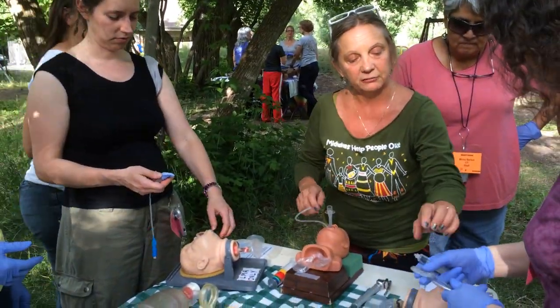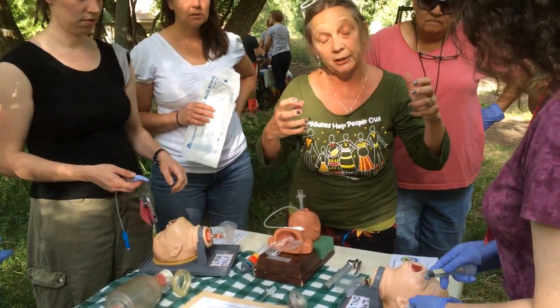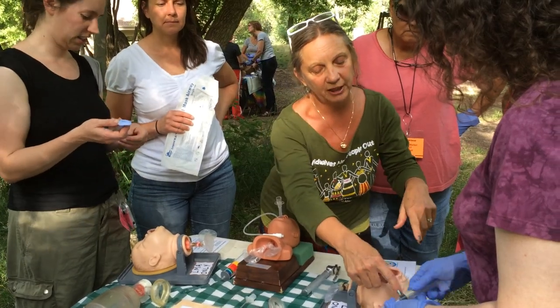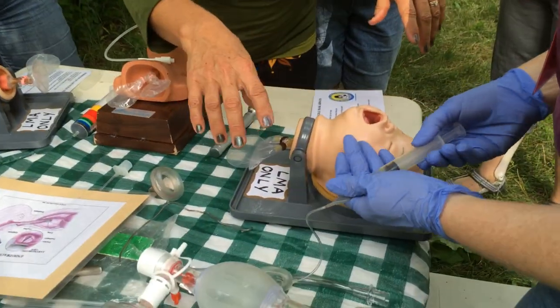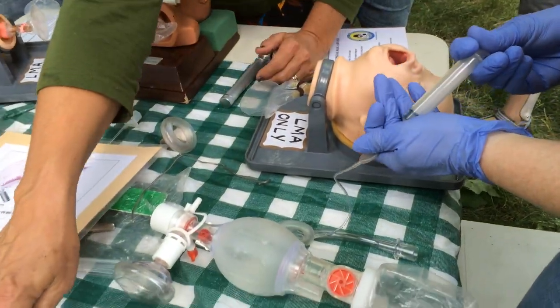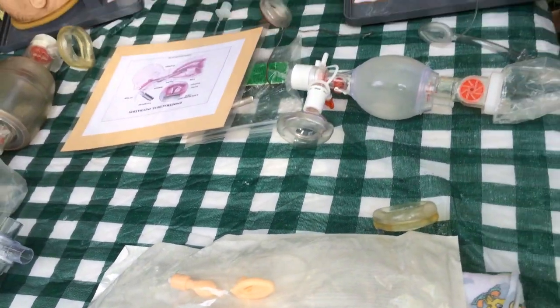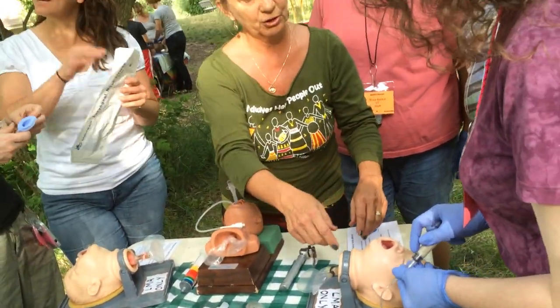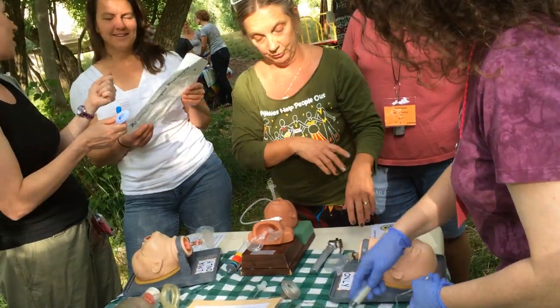It's got to be flat. Yours is flat already. So if you would, just so that your muscle memory does it right, Anne, put air in here and push it in. You would never do that. But because it would come full. The last product test before they let them out of the factory is to make sure they're going to hold air. So that's why they're full when you get them. There you go. Perfect. No, you just take that off and then no air will escape.